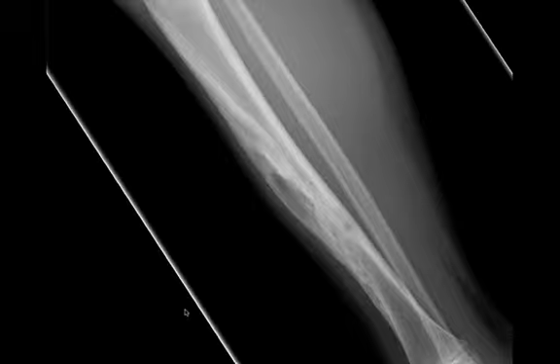Radiograph of the tibia and fibula, geographic mixed lytic and sclerotic lesion, narrow zone of transition, has a sclerotic border. This one is cortically based in the diaphysis of the tibia, so really involving the cortex and growing out of the cortex here, right? No nice normal cortex here, nice normal cortex here. So this lesion is growing from the cortex. Very kind of long and extensive.